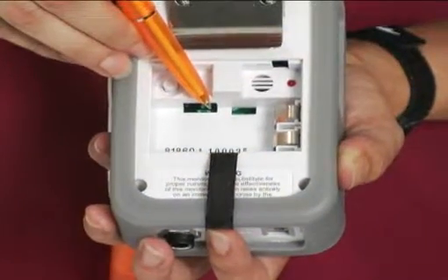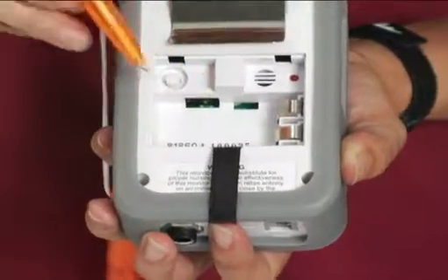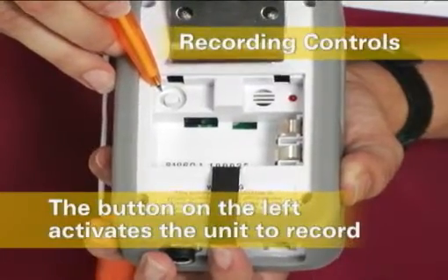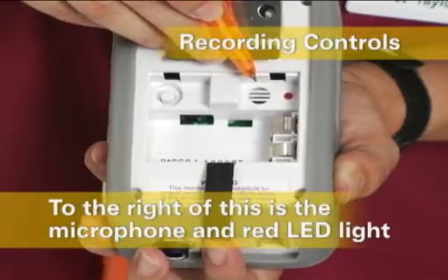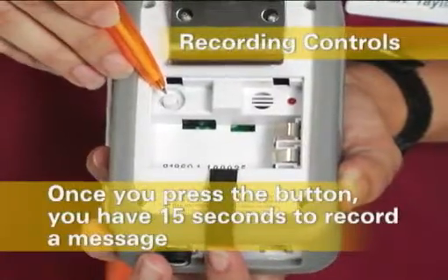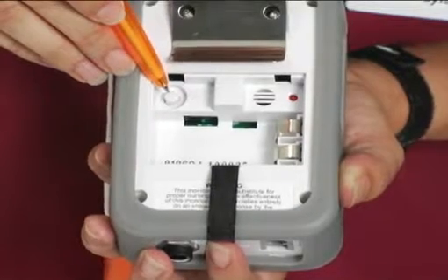If a nurse call cord is not plugged into the monitor, the unit reverts back to the local alarm. In the back of the Sentinel with Voice are the recording controls. The button on the left activates the unit to record. To the right of this is the microphone and the red LED recording indicator light. Once you press the button, you have 15 seconds to record a message. You can play back the message by simply pulling the cord and clip from the front of the unit.